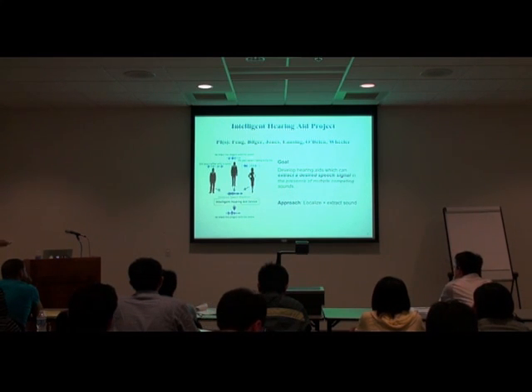Here is an illustration of an example. Let's say you have three talkers talking simultaneously in front of you. While the ear is picking up these combined signals, what we want to do is selectively pick up the signal from only one of them. That's this guy in front of you, right?